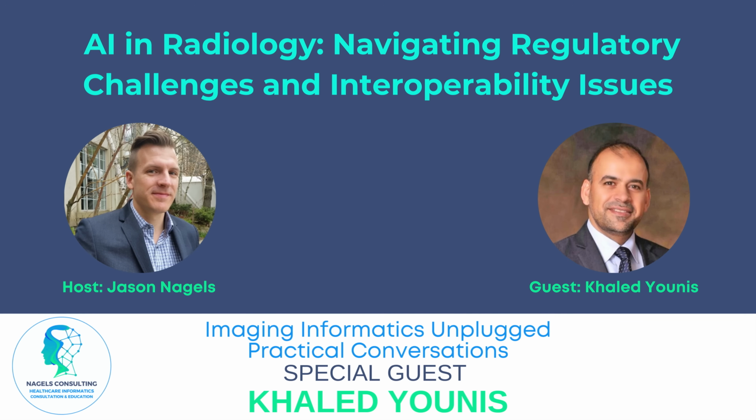The simulators can now provide a lot of reasonable data that is AI augmented or generated, and that could actually help balance the underrepresented groups. There is also the issue of reevaluation, because model drift is a common problem, where with time the data changes in characteristics from the initial data.